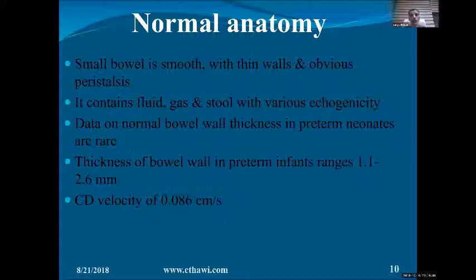Will you recognize any of them? No. You will hear them like a chorus because they are speaking together. That's a continuous Doppler. If you have the ability to shut up A, B, and D, and you're only listening to C, because you're putting the gate on that and ignoring the rest, that's a pulse Doppler. So what you're doing is shortening the area that you can see and ignoring the rest. That's the difference. How do you do that?